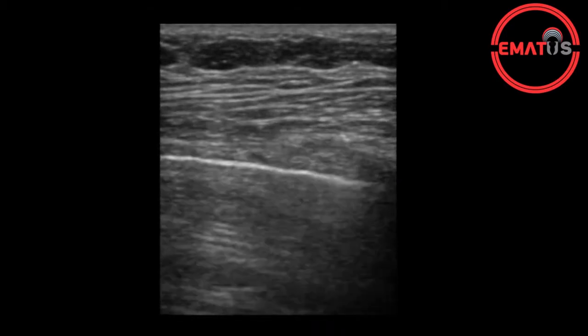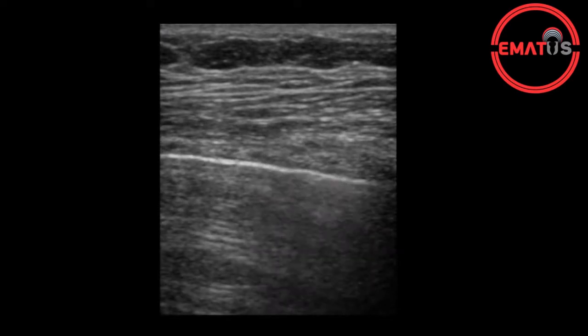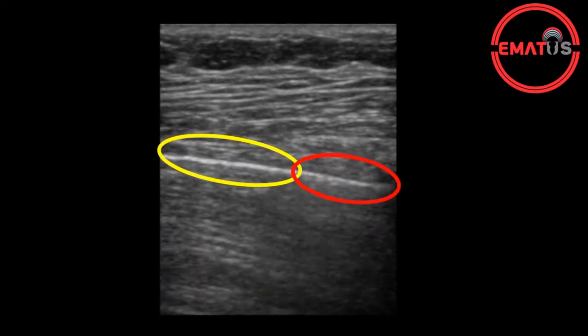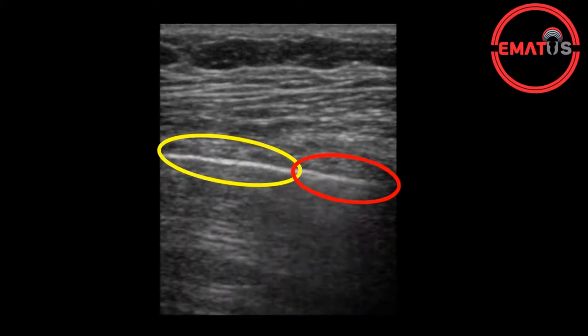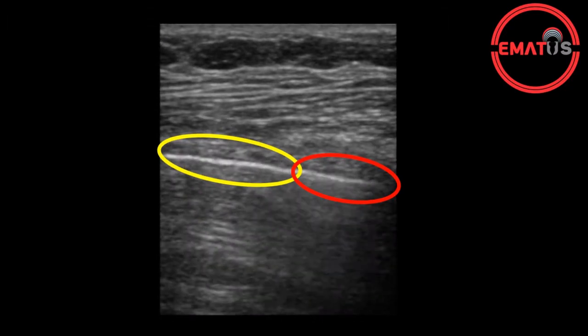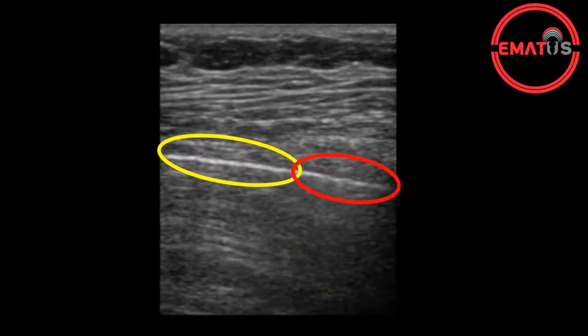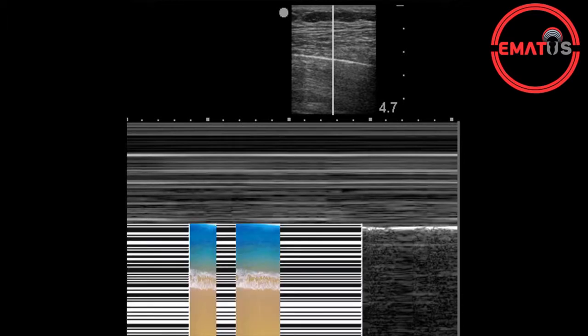Another finding referred to as the lung point occurs when the normal pleural moves in and out of your visual field with each breath. While following the lung sliding movement, you will see that there is a sliding motion on one side and no sliding motion on the other side. In M mode, the lung point sign is portrayed as alternating seashore and barcode patterns. This finding is known to have low sensitivity and high specificity.